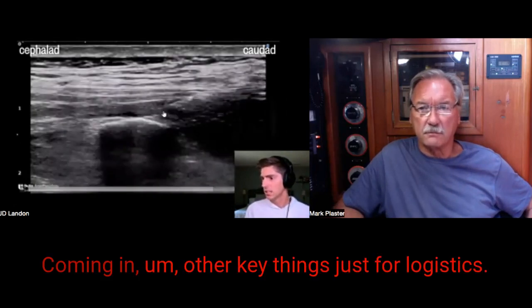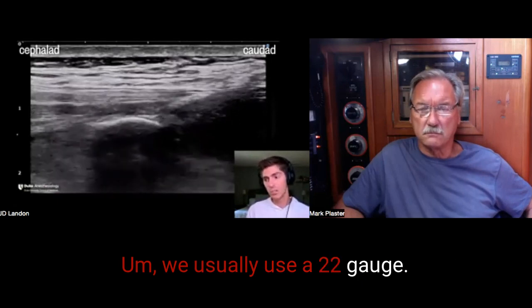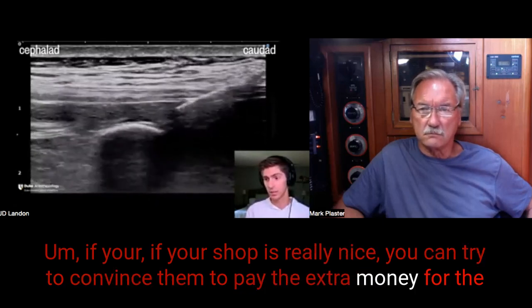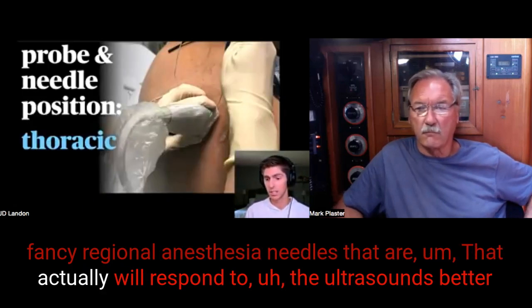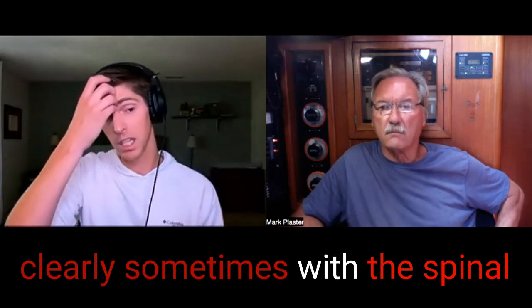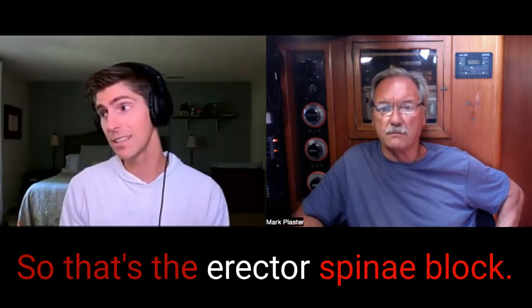Other key things, just for logistics: you're going to usually need a spinal needle for this. We usually use a 22 gauge. If your shop is really nice, you can try to convince them to pay the extra money for the fancy regional anesthesia needles that actually respond to the ultrasound better, and you can see them really clearly. Sometimes with the spinal needles, depending on your angle, you can have a harder time seeing your actual needle tip. So that's the Erector Spinae Block.